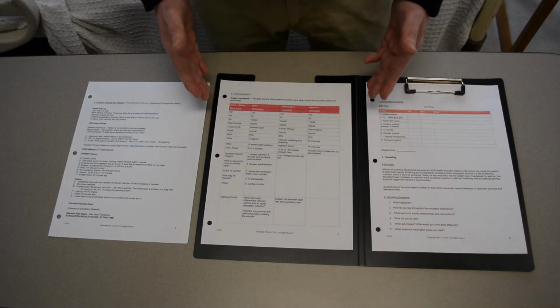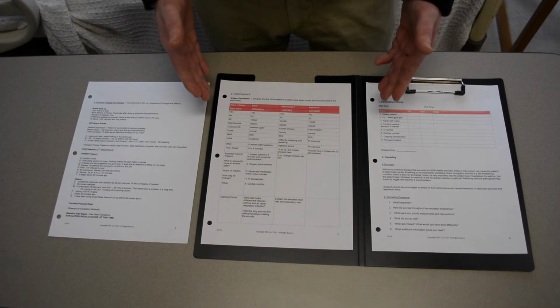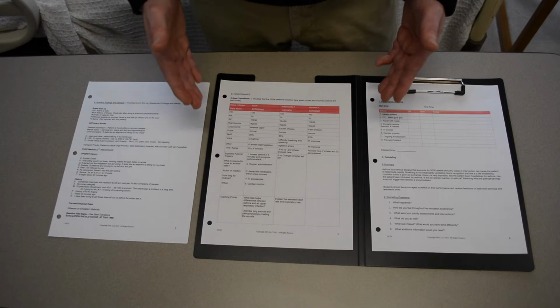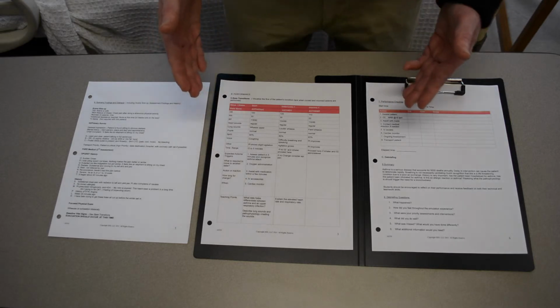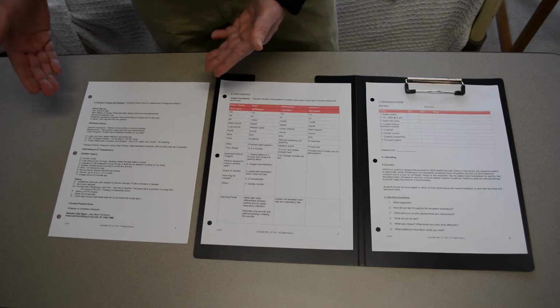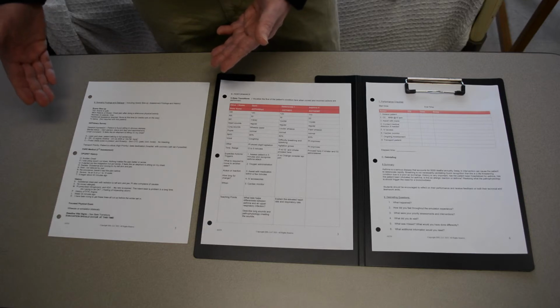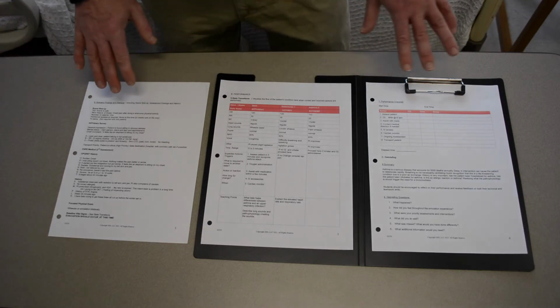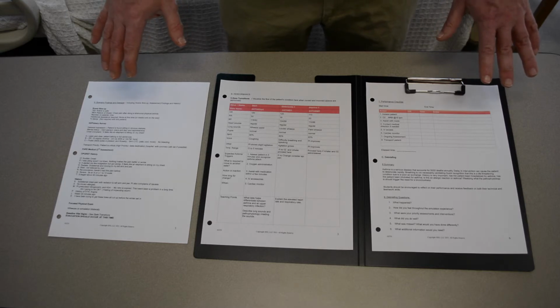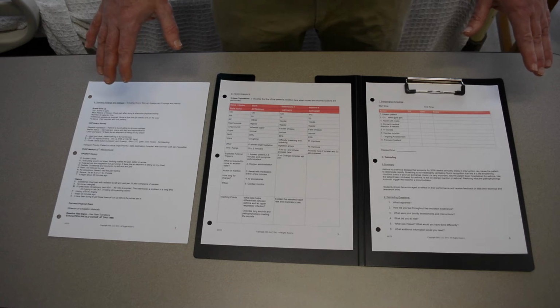We have a dashboard for the operator, which explains all the physiology, all the change points, and comments needed for that as well. And finally, for the voice, we have the pre-scripted responses, which ensures consistency across operators. So this three-part system allows somebody to very quickly run an efficient scenario, and with excellent debriefing questions as well.